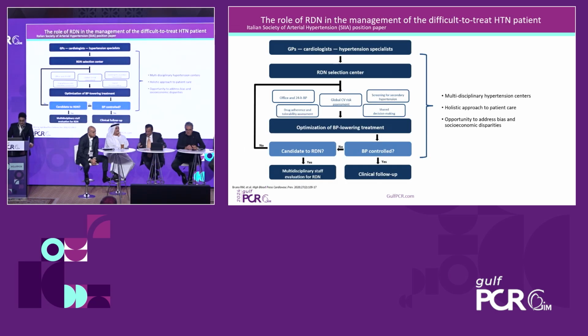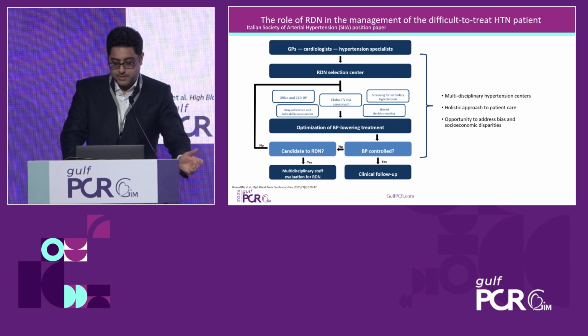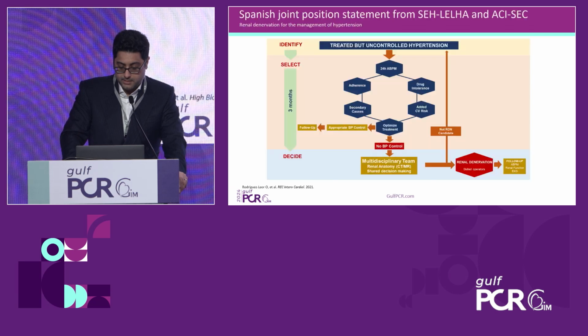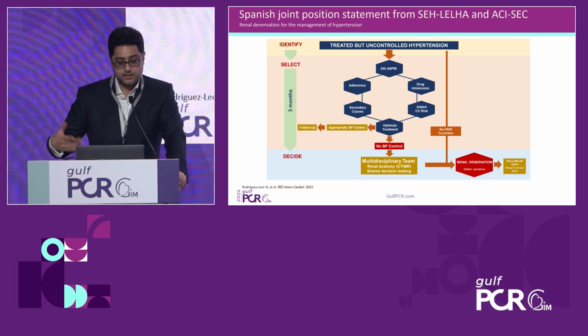Sure, I'm almost done. So this is basically the algorithm to refer a patient to RDN. I don't want to go through this. And then there are also some consensus statements that were published in Spain regarding how to manage patients with hypertension and refer them for renal denervation.